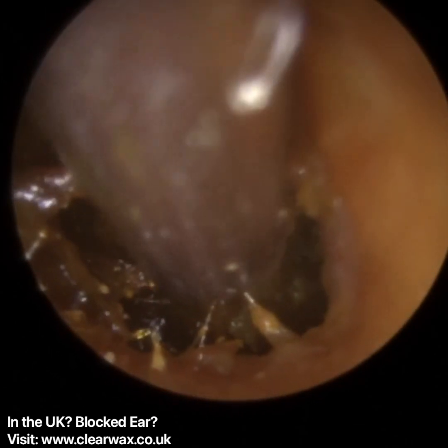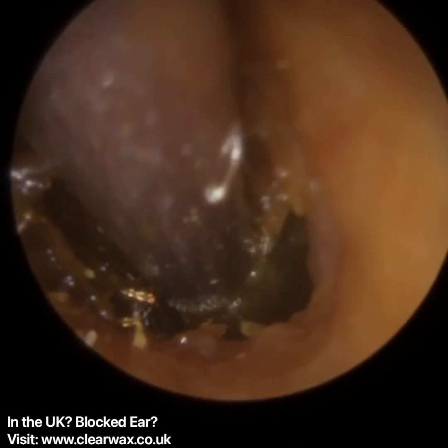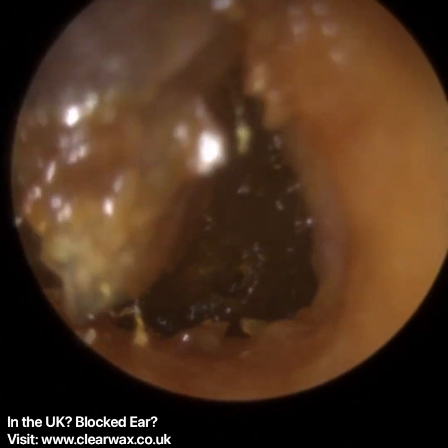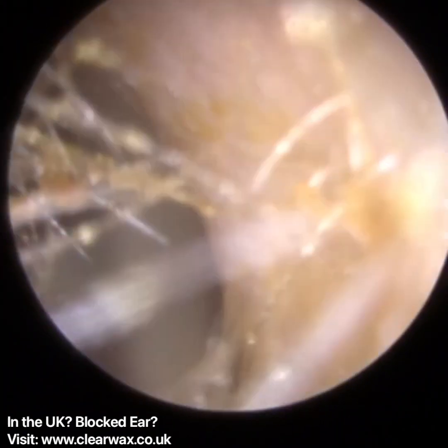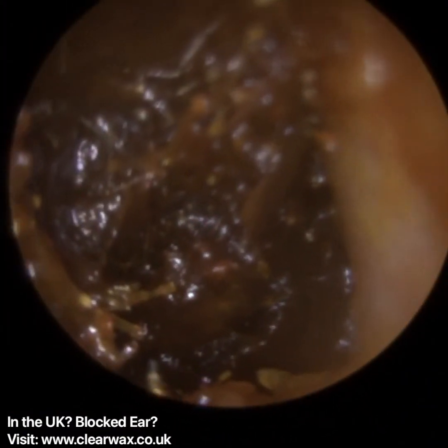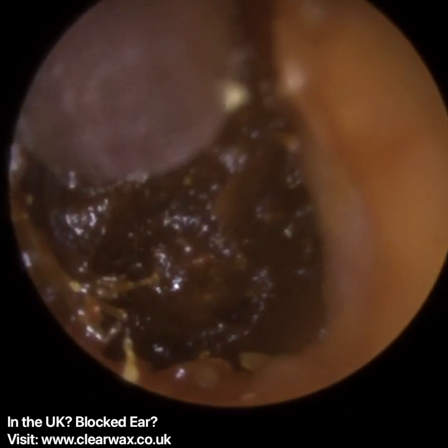So again, similar to the patient's left ear, the ear canal's narrow. I can kind of understand why my colleagues struggled using their visualization technique. They're not only going to struggle to get past this narrowing, they're going to really struggle with that technique to view very deep. This is right on the patient's eardrum.